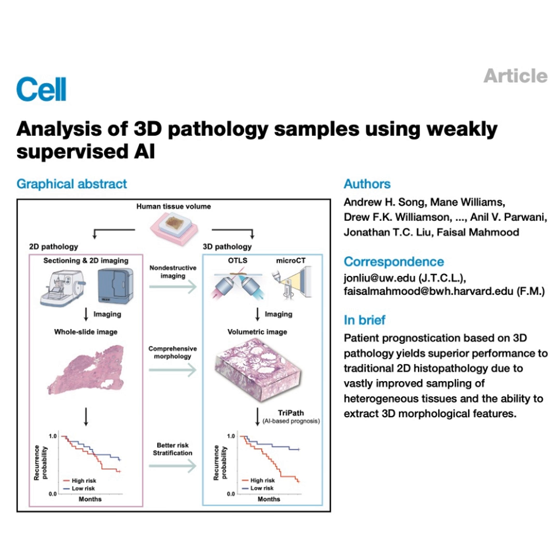Right. And then the third step, and this is really the clever part, is aggregation. Bringing it all back together. Exactly. You've got thousands of these feature vectors, one for each patch. The system needs to combine them all to make that single final prediction for the whole volume. Did the cancer recur? Yes or no? And it uses something called an attention-based aggregation module. Attention. Like, it pays attention to certain patches more than others.